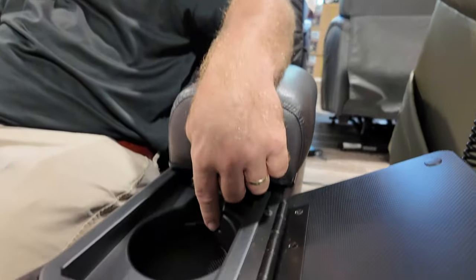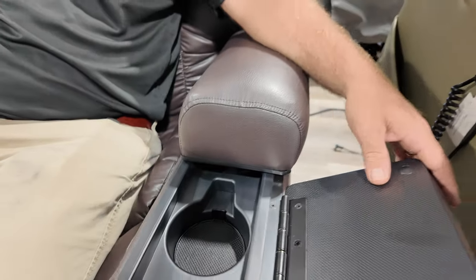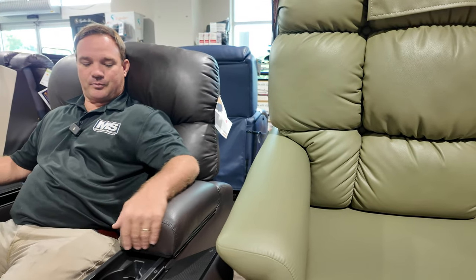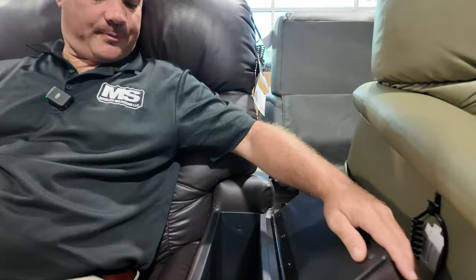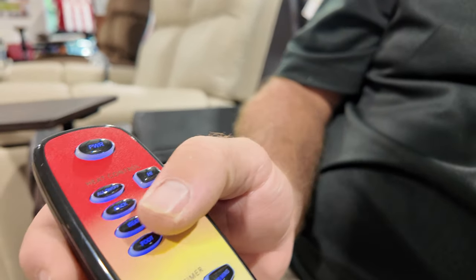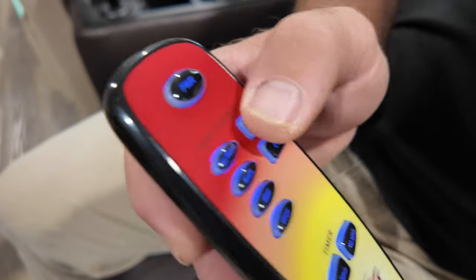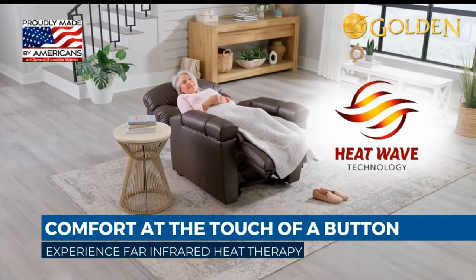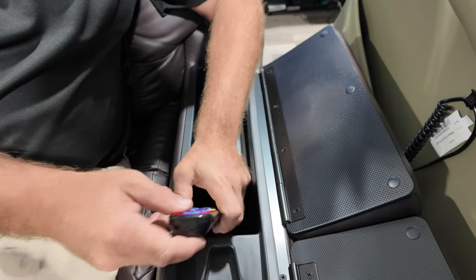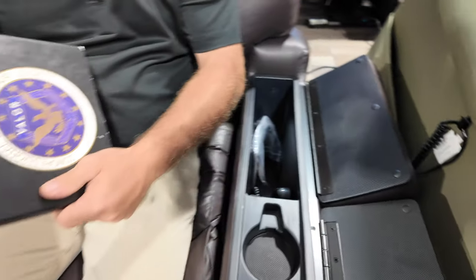On the other side is where your coffee cup goes. On the opposite compartment, you have a large storage capacity. And on this other side you have a nice storage compartment with your infrared heat wave — you can heat the foot, seat, back, or all of them. Settings include 30 minutes, 60 minutes, high or low power, and a full heat option. If you do want heat and vibration, that's an additional charge and you'd lose the infrared heating.